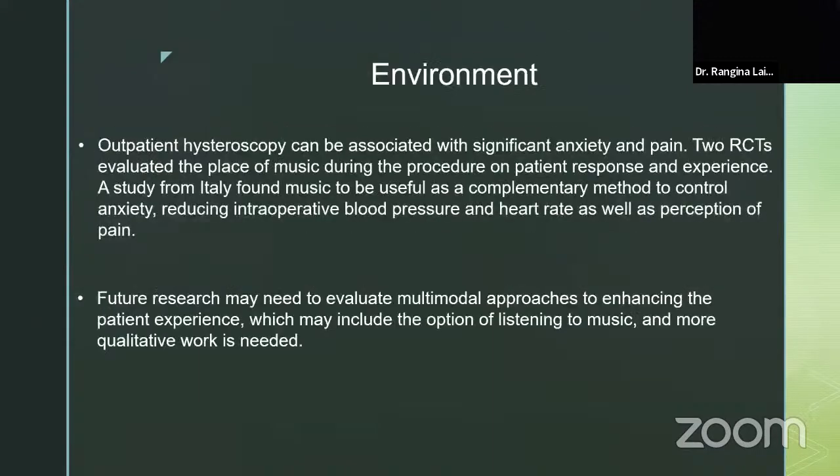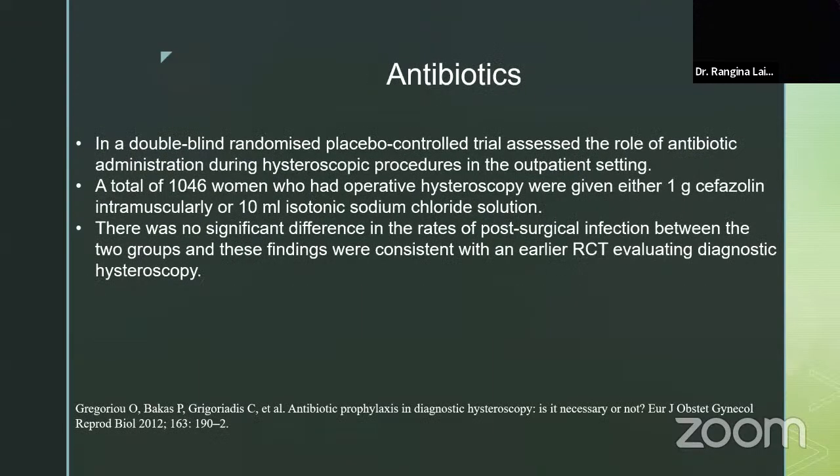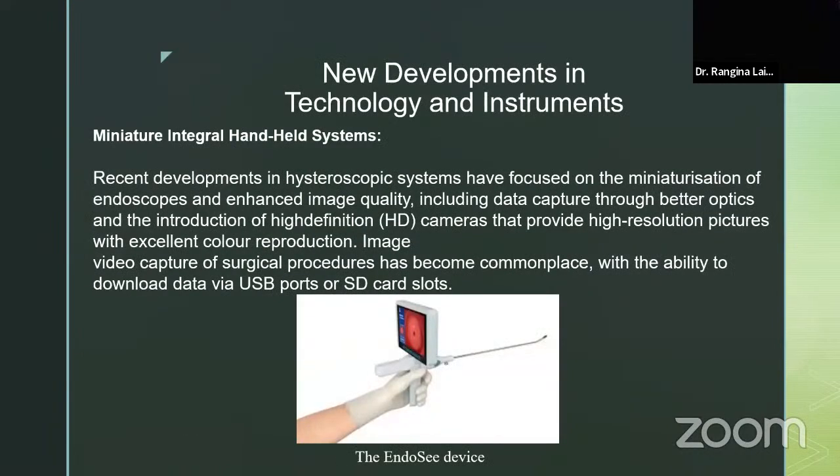About antibiotics, yes, I of course give antibiotic coverage in most of my patients because PID is very common in Nepal. About new developments, there are lots of new developments coming up in hysteroscopy. I would also like to add the Bigatti shaver.